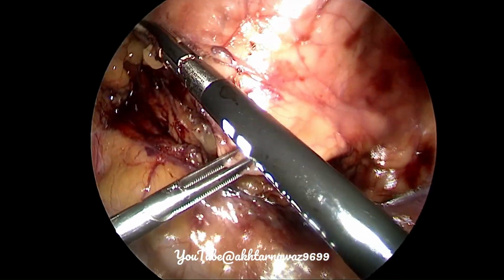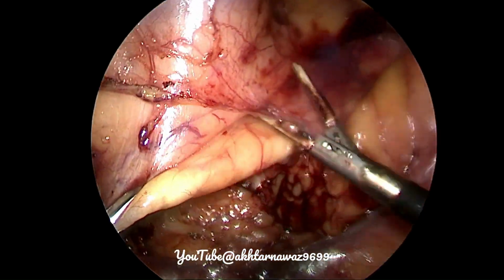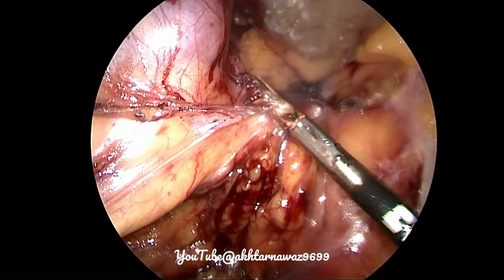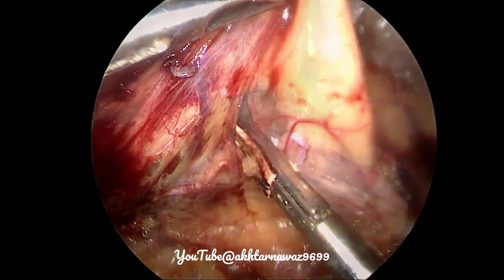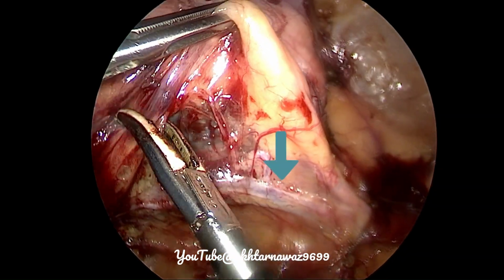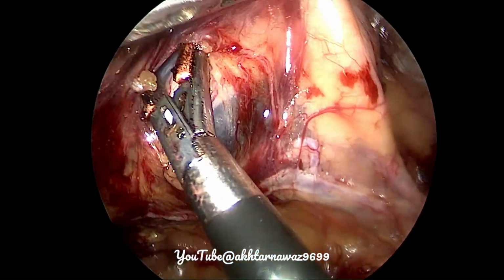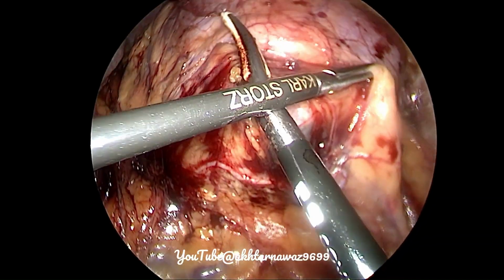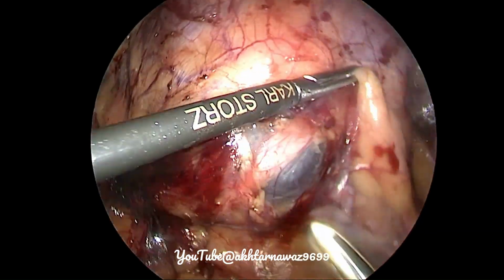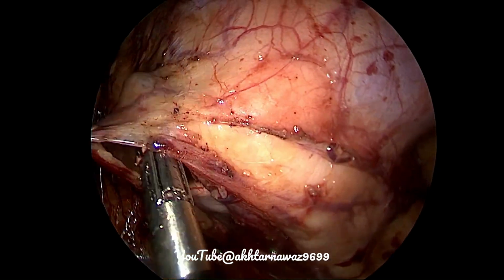So we grab it with the non-traumatic forceps and we try to dissect the tissue away, so as to follow this ureter up to the cyst. This is the gonadal vein showing the pointer. And this structure seen behind is the parapelvic cyst, and you can see that a structure is crossing. Yes, this one, and this is the upper calyx.